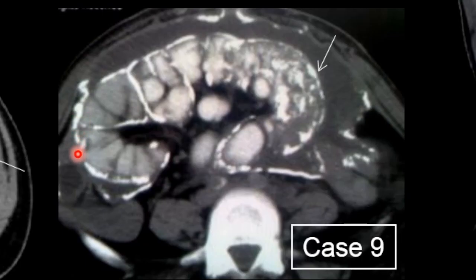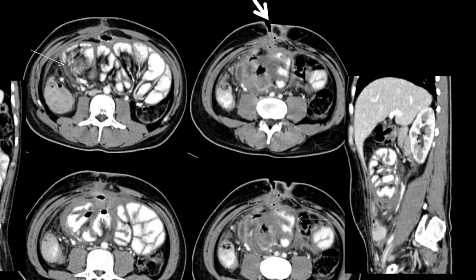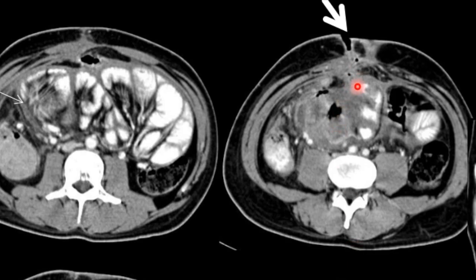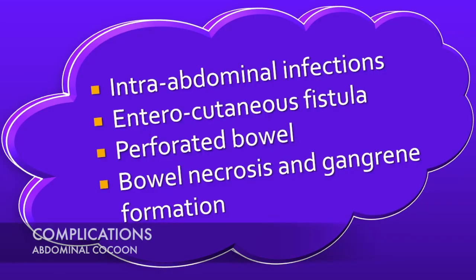The walls of the membranes forming the cocoon are calcified, and when calcified walls are seen it is more likely related to chronic peritoneal dialysis. The tenth case shows multiple clumped bowel loops with adjacent membrane. Importantly, there is a defect in the anterior abdominal wall through which it opens externally, suggestive of enterocutaneous fistula formation.